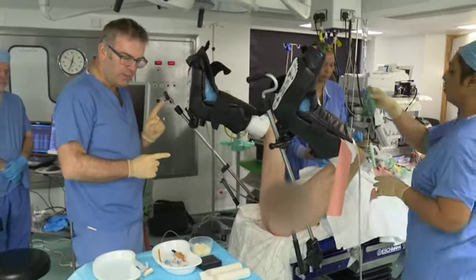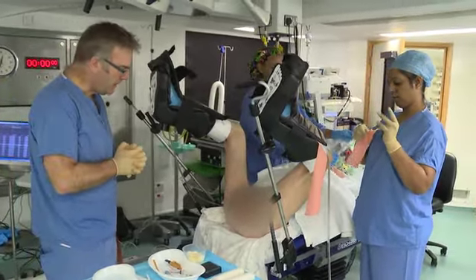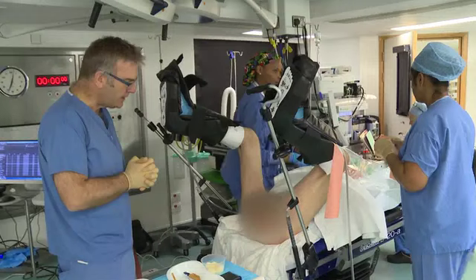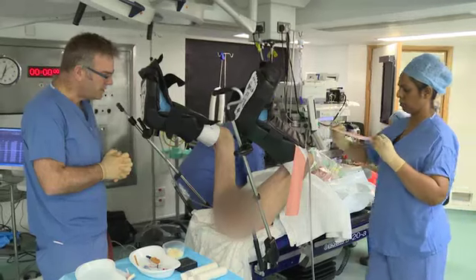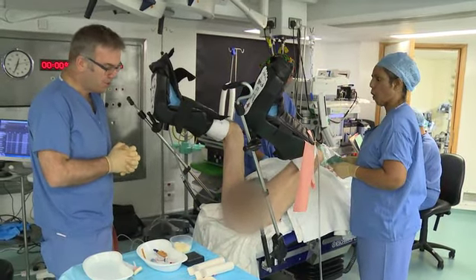I've biopsied him once, and those biopsies came back negative. That was a cognitive biopsy. Since then, the lesion got stronger on MRI characteristics, and the PSA has gone up to 2 point something. And I've suggested to him that it's time to rebiopsy this. So we're going to use an image-guided system.